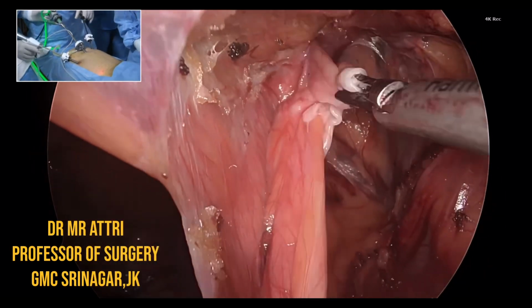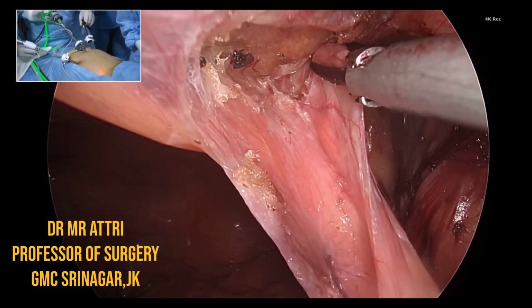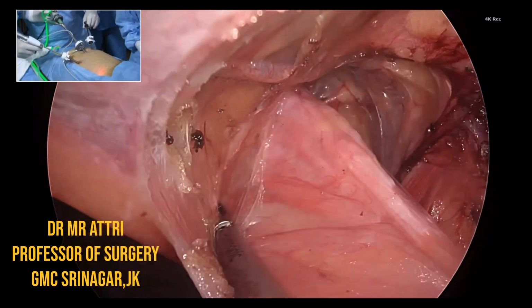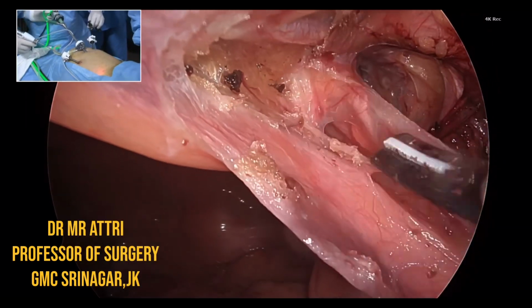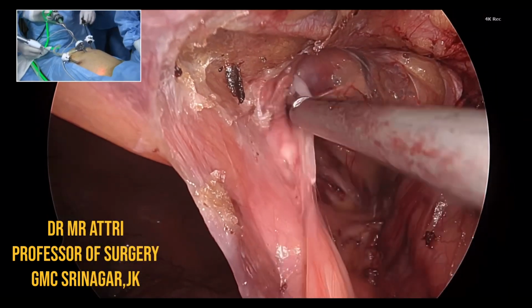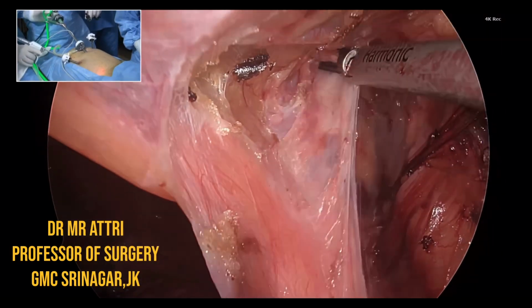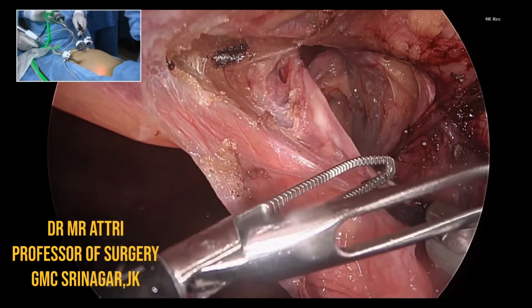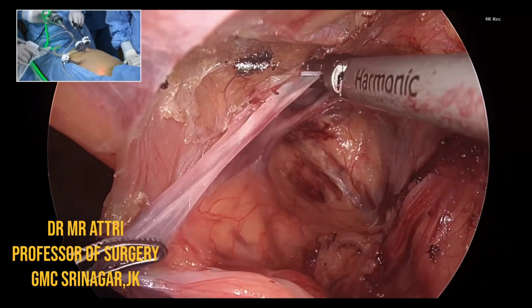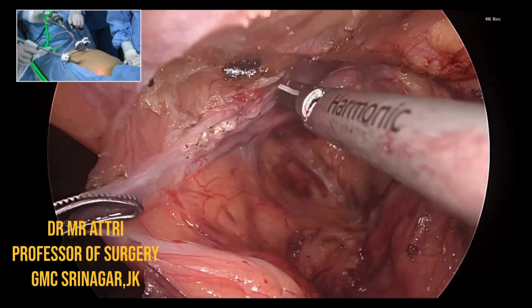And I think working in the roof and letting the peritoneum fall with it is easier because you get a natural pneumodissection. The peritoneum falls. I think these cases are very easy to do by the ETEP technique. The moment you get your correct TAR plane, most of the things become automatic with the pneumoperitoneum. So a lot of things which we do even in TAPP are done easily by pneumodissection if we get to the right plane. So I feel that right-sided ETEP TAR without crossing the midline would have been easier. We do it very frequently and we find it easier than doing IPOM and TAR. That's my take.